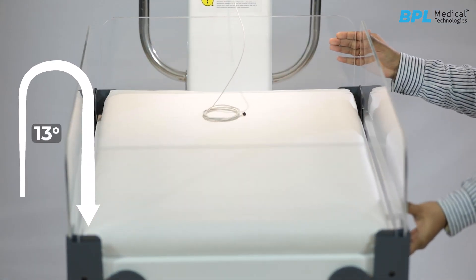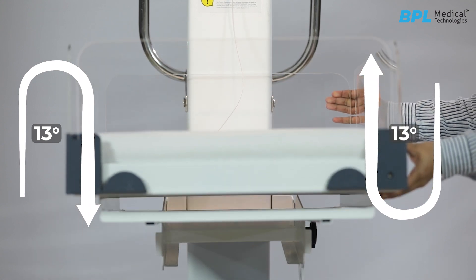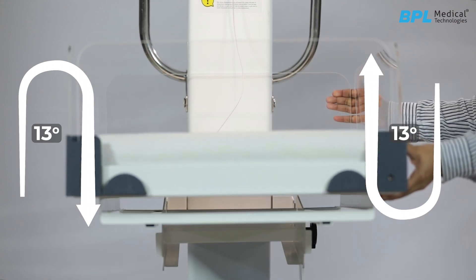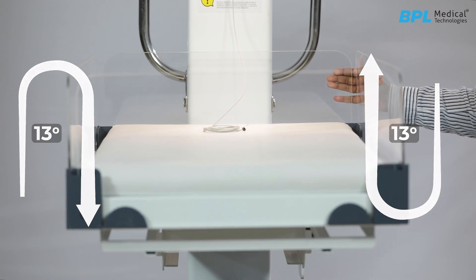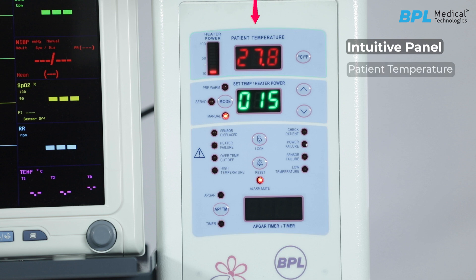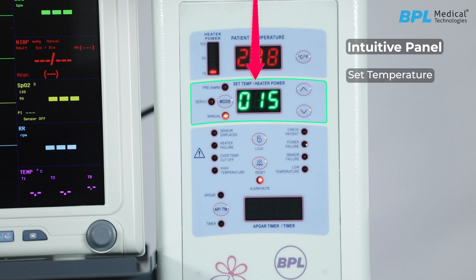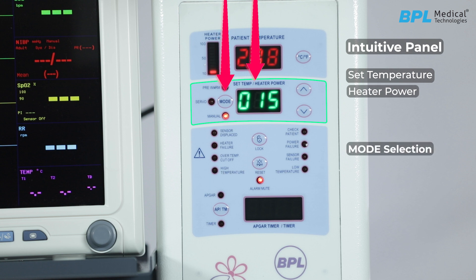The Fluorate 1000 baby warmer bed can be tilted 13 degrees on both sides for various procedures. It has an intuitive panel that displays the patient temperature and heater output, with selection between centigrade and Fahrenheit. It also displays the set temperature or heater power, along with mode selection including pre-warm, servo, and manual modes.